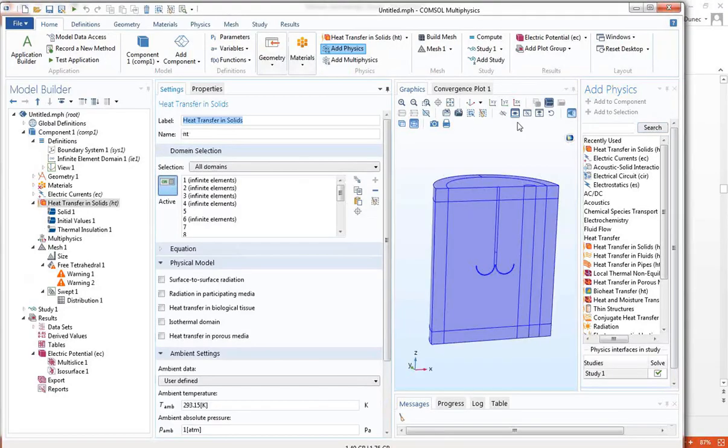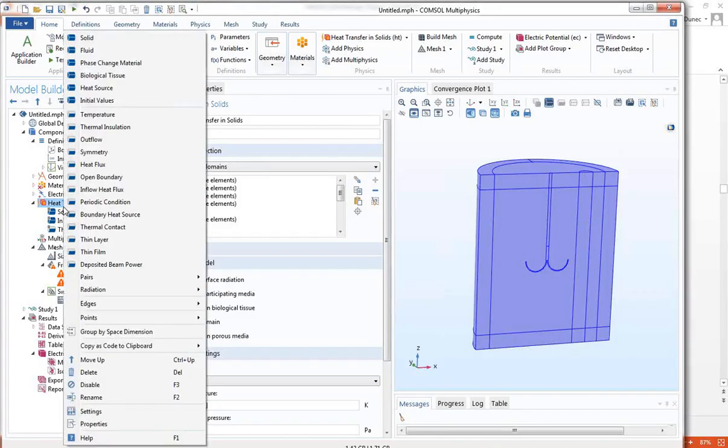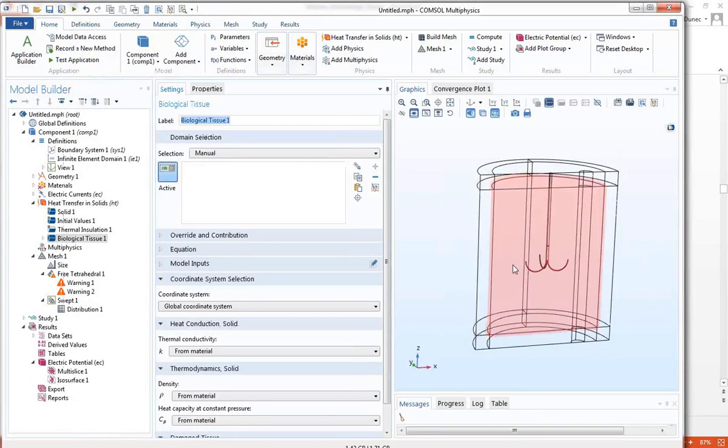Okay, so now it says, okay, I'm going to calculate heat transfer everywhere. Excellent, that's what I want you to do. Now, I am going to have biological tissue in some of this, so I'm going to choose heat transfer in biological tissue. And it says, oh, you do? Where is this heat transfer? So I'm going to right-click, and I will do biological tissue, and I will choose this area, the middle part.